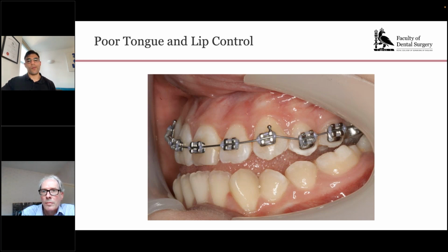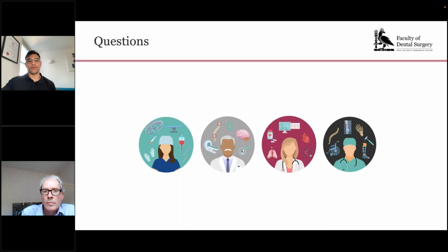Okay, Noor Zakaria asks, what do you think of smartphone photography with an accessory that resembles a ring flash? Many people are using mobile phones in my region. Yeah, it's not as good. It's not as good for various reasons. You can't control the exposure on a smartphone in any way as well and with as much precision as you can on a proper digital camera.